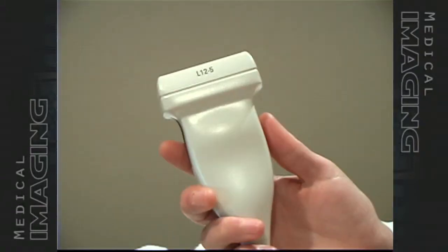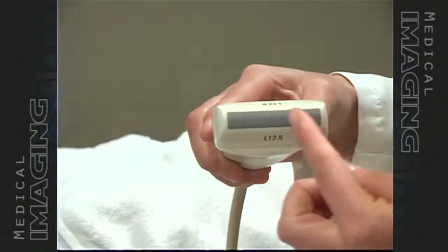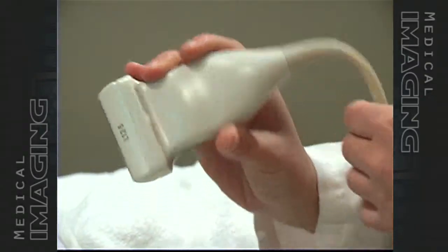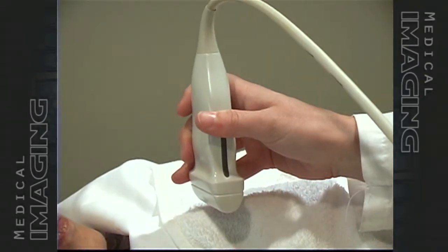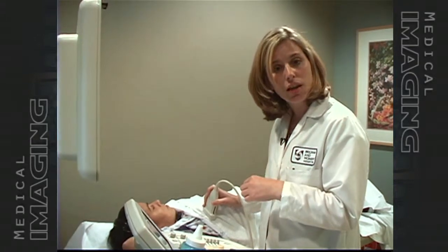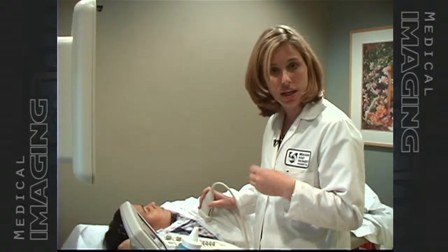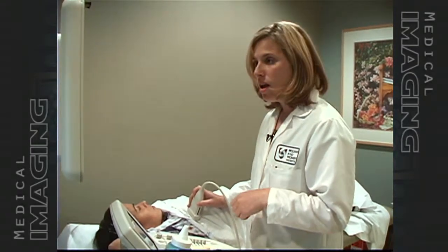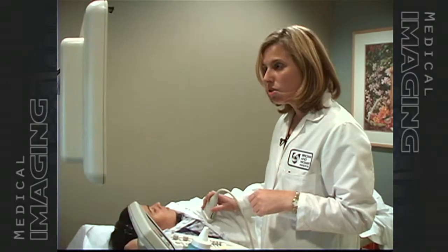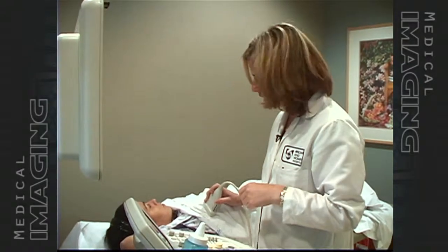This is the ultrasound transducer — a high-frequency transducer that we typically use to see in thinner tissues, like breast tissue. We scan right over the area that the patient indicated, or in the area that the mammogram indicated there was an abnormality, and we look on the ultrasound screen to try and identify exactly where the abnormality is.